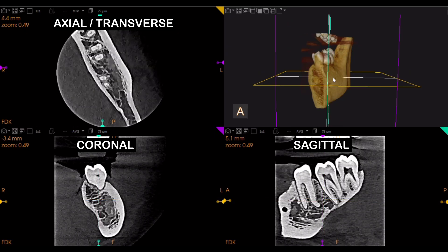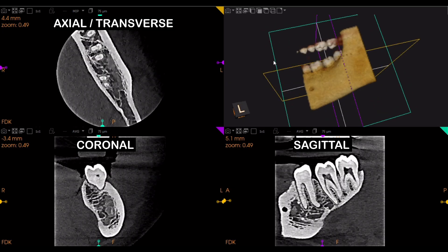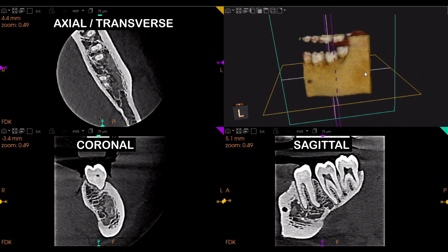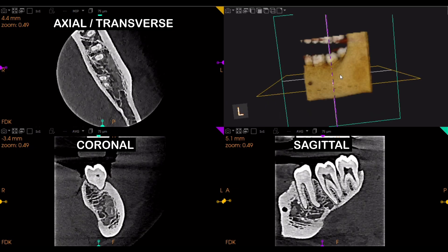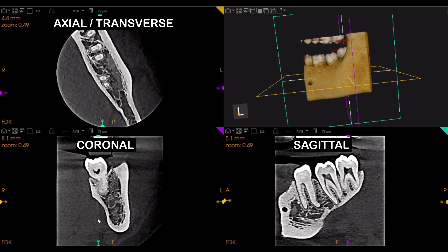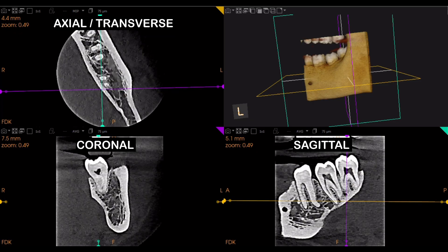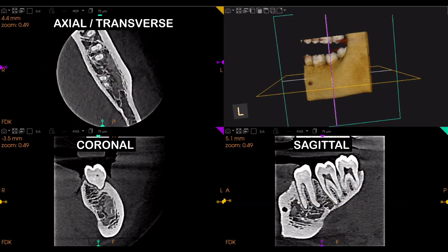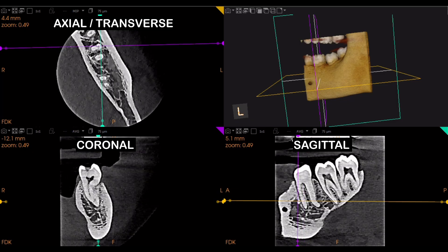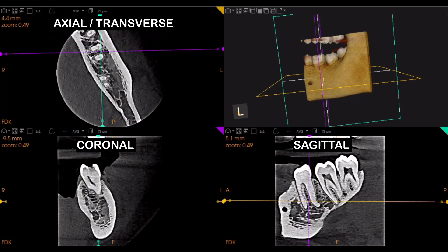The next wireframe is the purple one. This purple wireframe is dividing the structure into two parts: the anterior part and the posterior part, or front and back. At the point where you cut the structure, the section you get is known as the coronal section. As we move this purple wireframe from back to front, you can see the structures changing in the coronal section. It divides the structure into front and back, and at that particular point when you cut the anatomical structure, what you see from the front view is the coronal section, also called the frontal section.